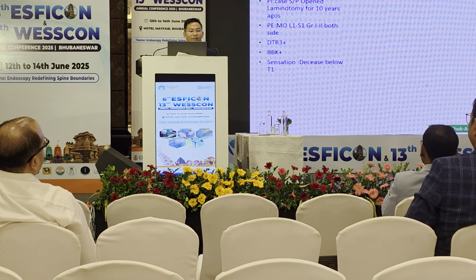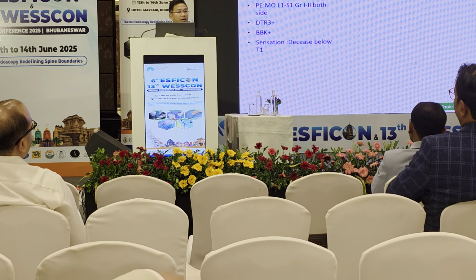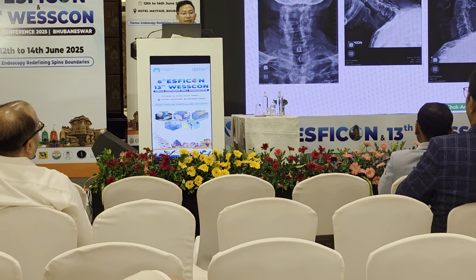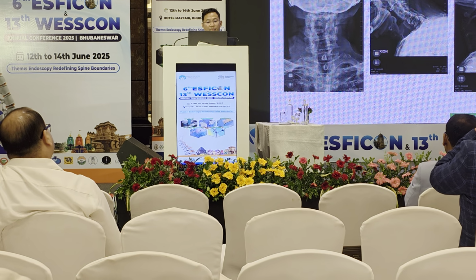Another case is the last case for me. A 74-year-old male. He came to me with adjacent segment disease in the cervical spine and myelopathy. I diagnosed CSM, but from adjacent segment disease.